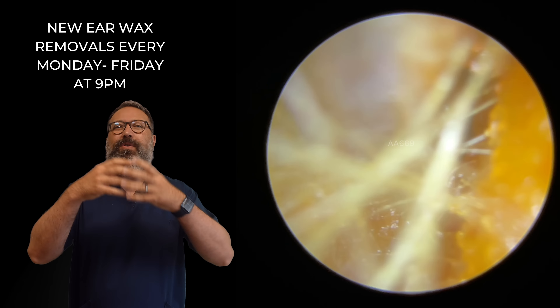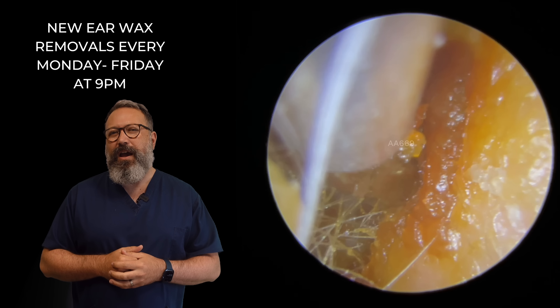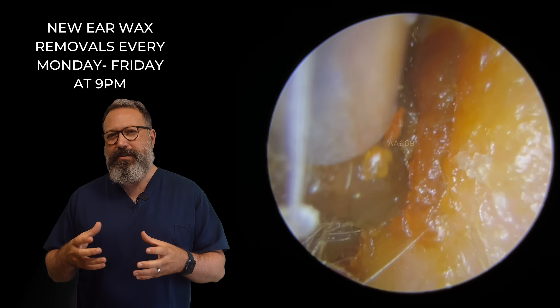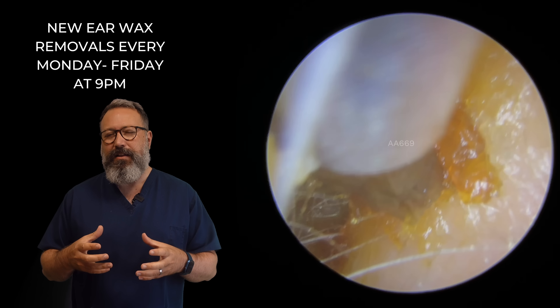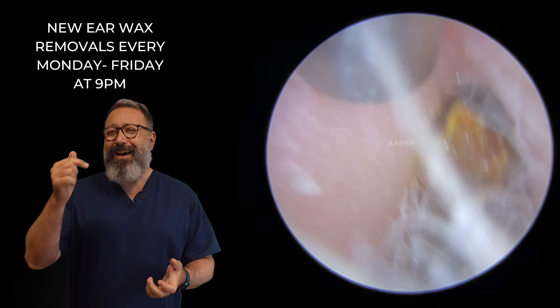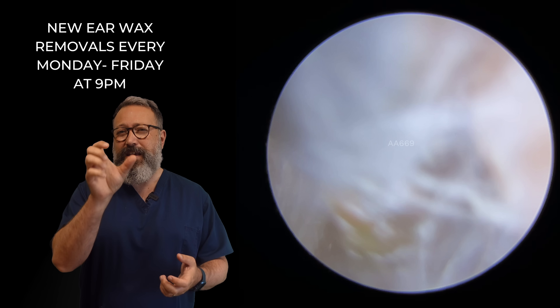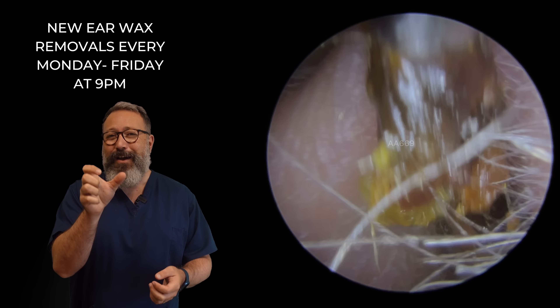What you can see here, we've got some quite dense cilia at the entrance. We do get past these in a little bit, but you'll see these longer, hard strips of wax that come away in this particular patient's ear canal. Now this gent has to come through roughly about every six months to get this done. You may remember recently we put our sort of biggest ear wax plug that I think I've ever taken out of somebody's ear up.